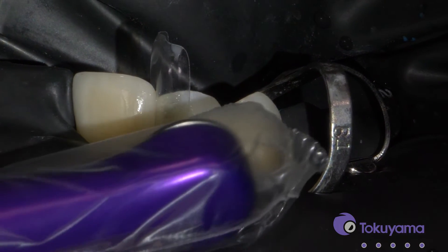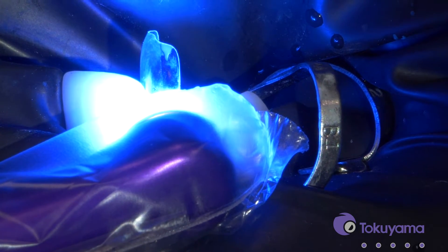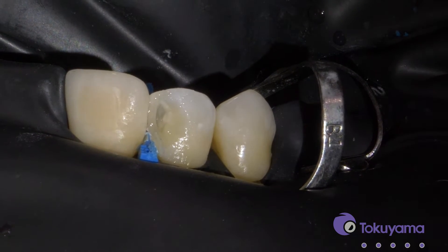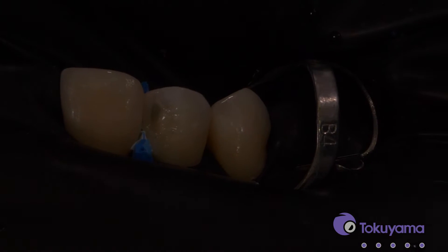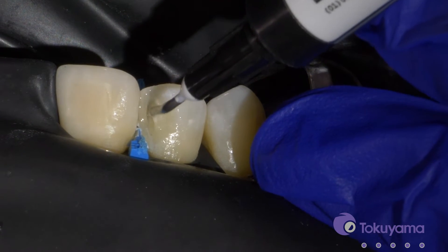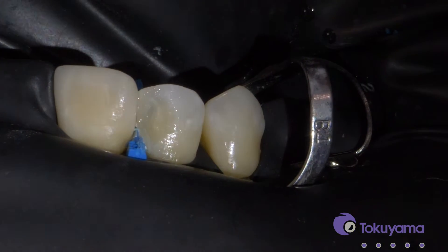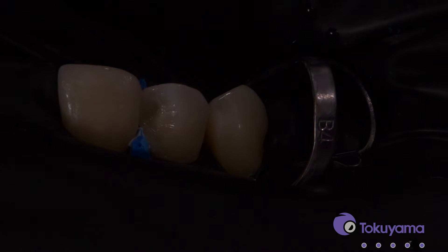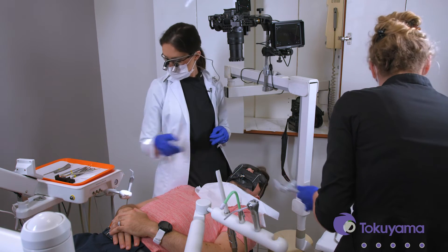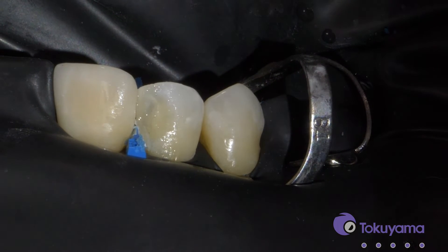When you cure it, it will match that tooth. So let's hit it with the light. Once we cure this, I'll remove that curved mylar and then you can see better. See, it does match. So now we're going to apply the blocker just where we want the dentin to be. Now that we have our mesial wall built in, we're going to put the blocker in the areas where we expect the dentin to be.